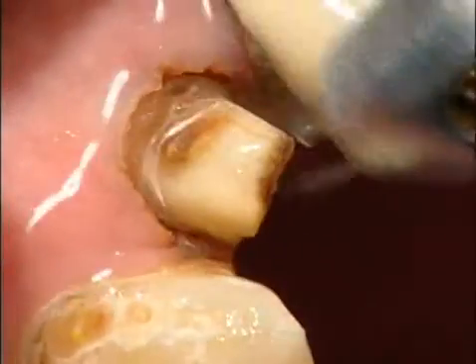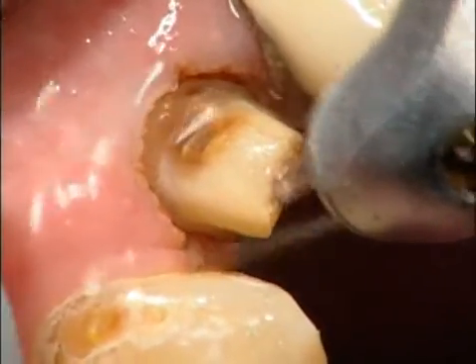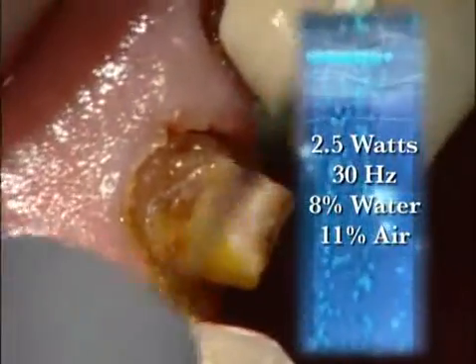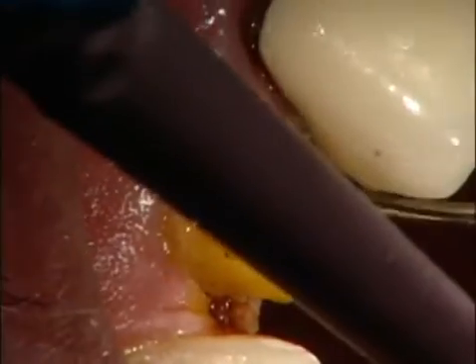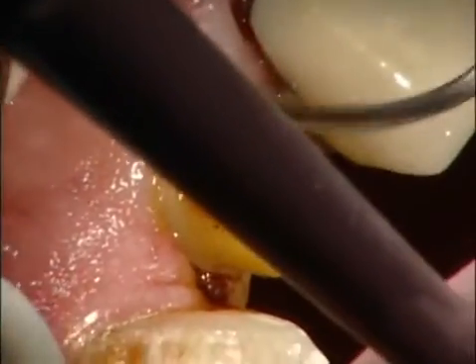We're just doing our fine-tuning, final smoothing, 2.5 watts, 11% air, 8% water, 30 hertz. A little Viscostat one more time, to help me control the crevicular fluids just before I take my impression.